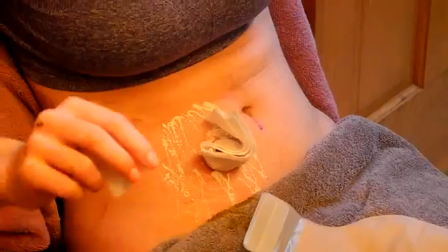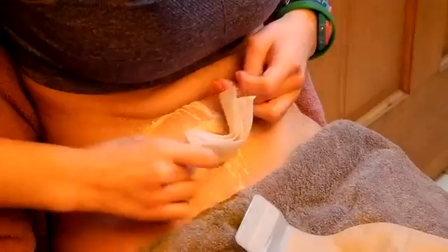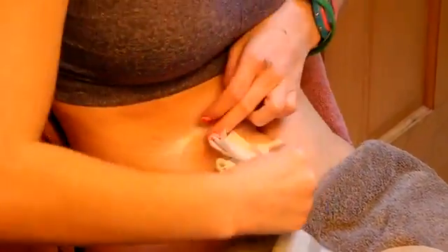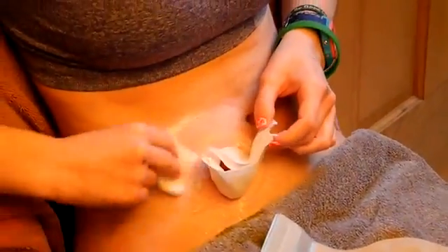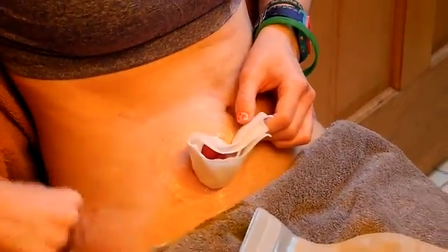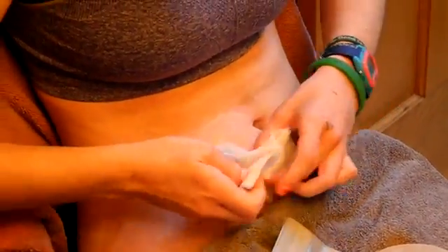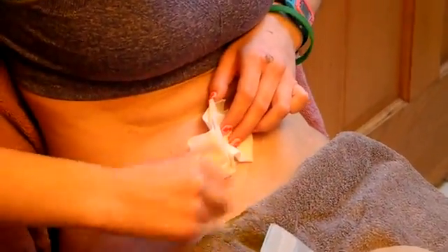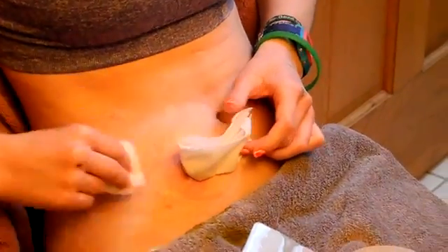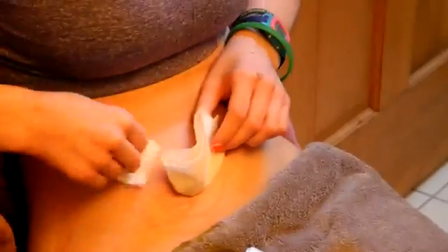And then you want to brush it off so that there's just a little bit of stoma powder. She brushed it off a lot more. Yes, she did, I know. I'm working on it. So, we went to a stoma nurse because I had like 3 leaks because my skin was in such bad shape. And she really brushed off the stoma powder so there was almost nothing left, kind of like that. So, I'm just going to try and imitate her because it seemed to stick really well. Okay, so that looks pretty good.